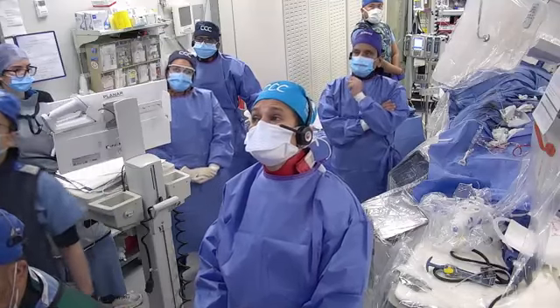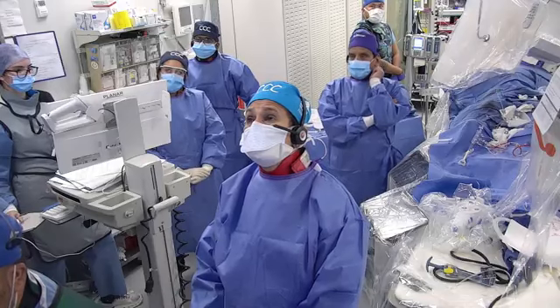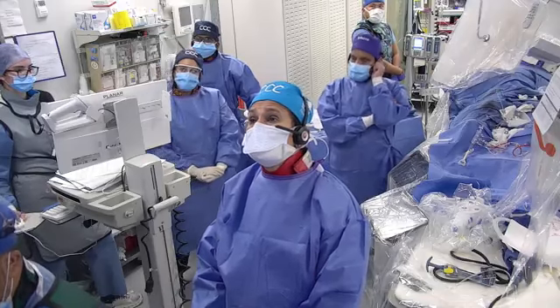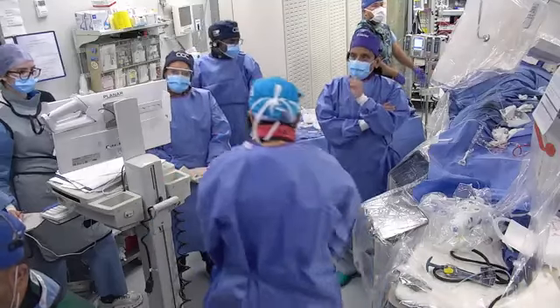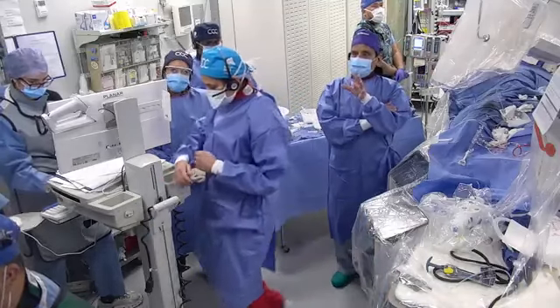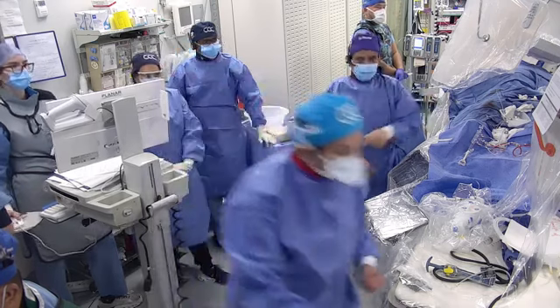Hemodynamically, a little unstable patient, would you choose rotablation or orbital? What is your preference at your center, sir? Beautiful point. So the question comes down to this: until now we learned that slow flow happens less with orbital versus rotational atherectomy, right? Because of the particle size and the fast flush.